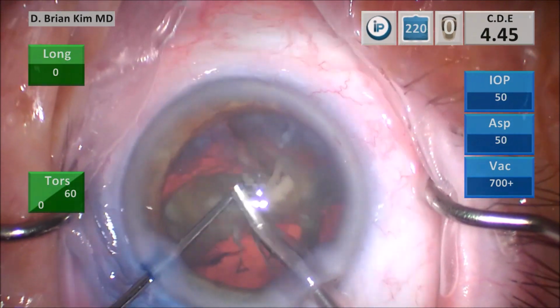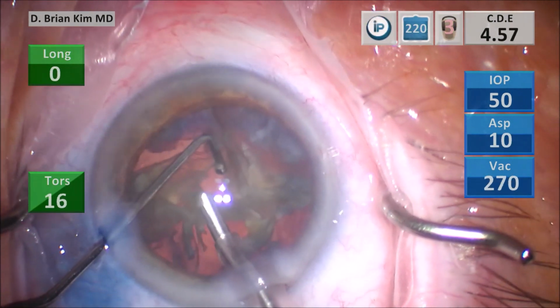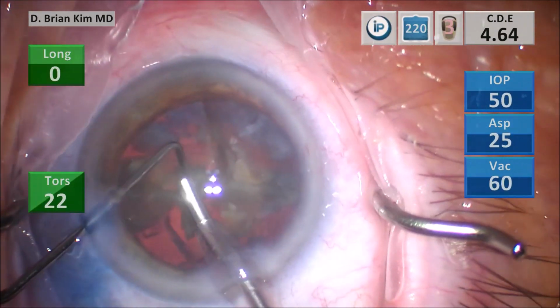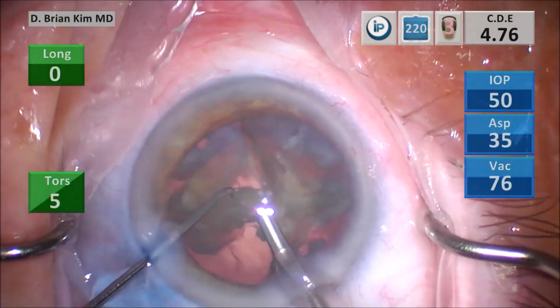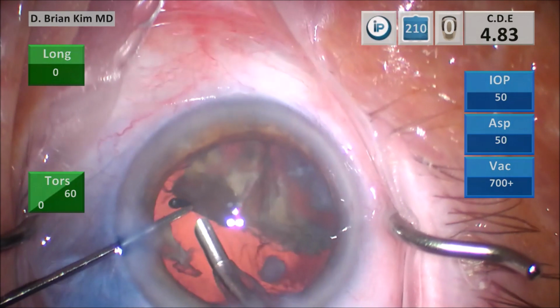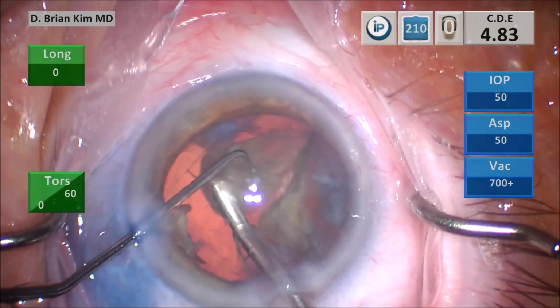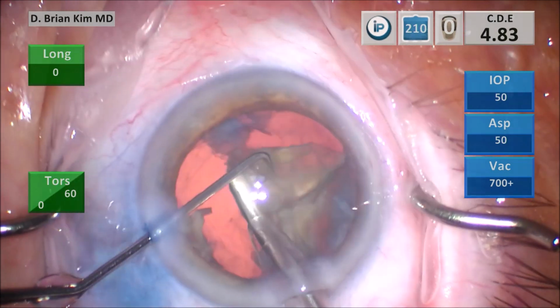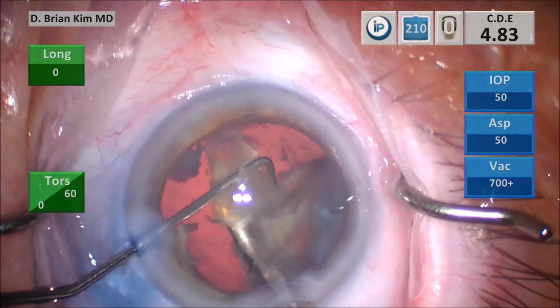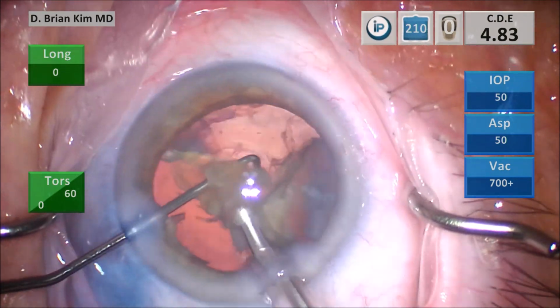What's interesting is there are some kind of laminations or layers and layers, almost like peeling off an onion with these super dense lenses. So even though the entire lens is dense, the more peripheral lens material is a little bit softer, and that real central core is really the hardest part. But you can see as I'm trying to eat the pieces, they start to kind of separate within their lamellar shells.